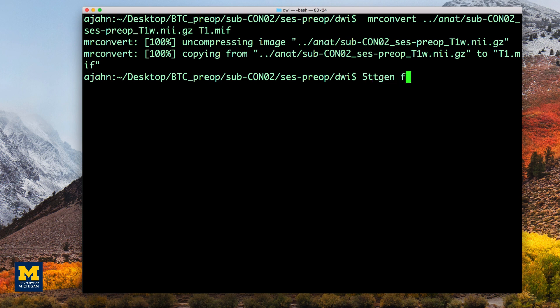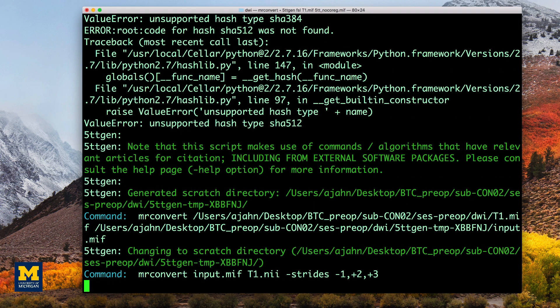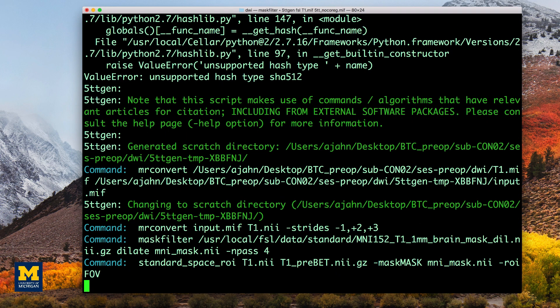We will then use the command 5ttgen to segment the anatomical image into five different tissue classes. This will take a while, about 10 to 15 minutes.